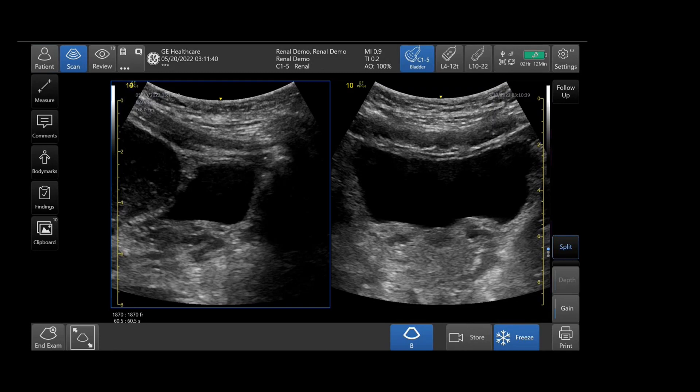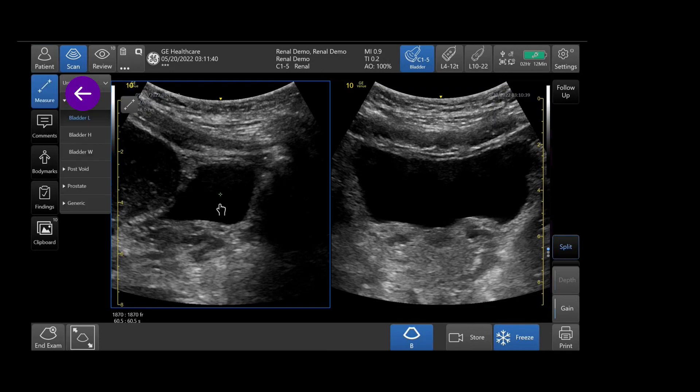Next, we will activate the measurements from the measure button. Here you will be prompted to measure length, height, and width of the bladder.